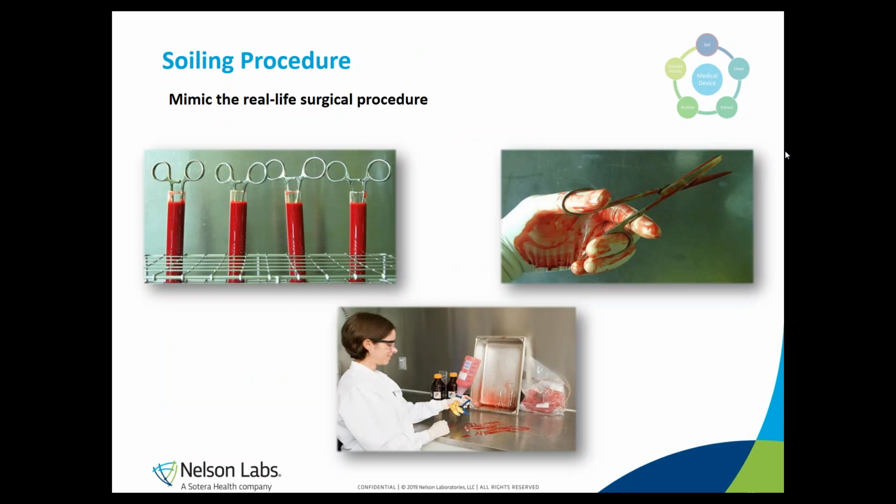Our soiling procedures itself should mimic a real-life surgical procedure as much as possible. And you can see some examples here on how a real-life surgical procedure can be mimicked in a laboratory during a validation. Devices may be immersed in a test soil, either completely or partially, whichever is applicable during surgery.